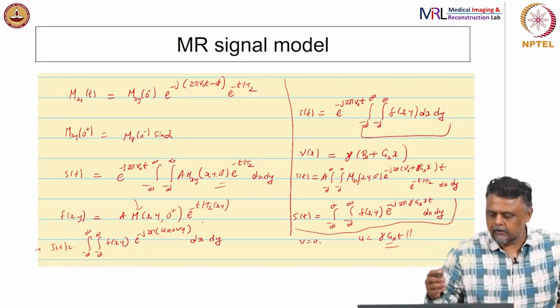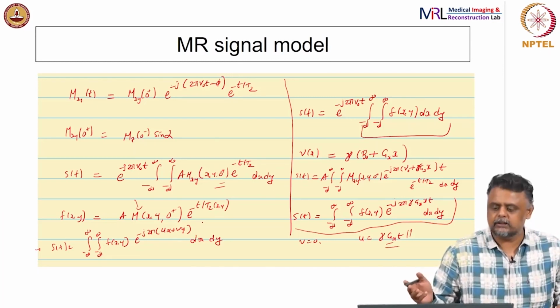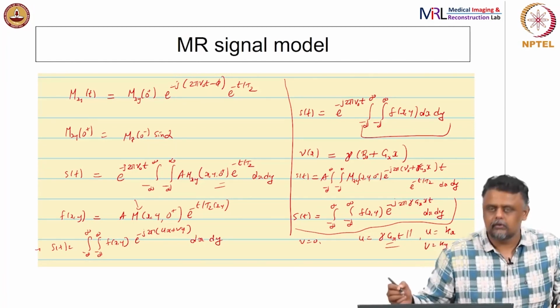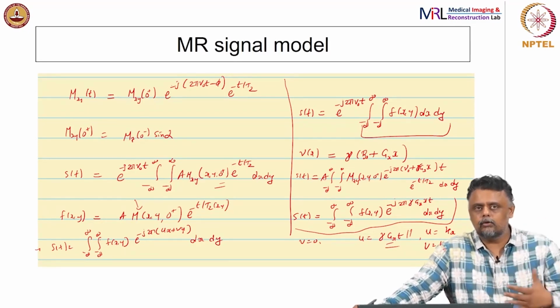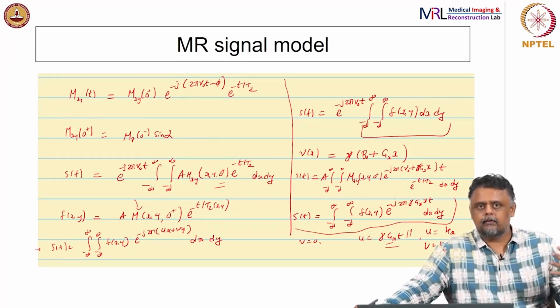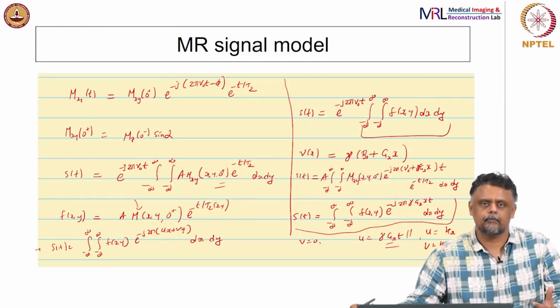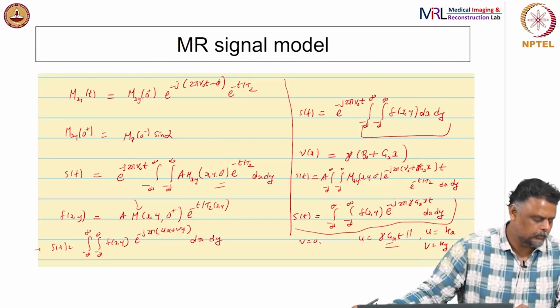And one of the terminologies in MRI is that it is called K space, right. So, you will call u would be kx and v would be ky, okay. All right. So, this is referred to as K space, right. So, you would have to measure all of K space in order to figure out the Fourier transform, and then you invert it, right. So, that is the acquisition strategy in MRI, right. So, this is the first step towards casting it in the form of a Fourier transform, okay.